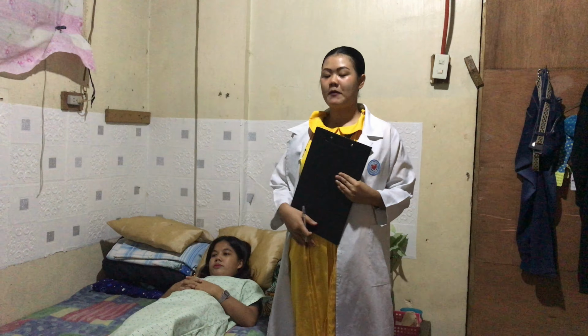So, I'll just check this. For the procedure that I will be doing on the client, after I check it, what is the rationale behind this? The rationale is to ensure accuracy and to prevent any errors. The next thing that we will be doing is to check the materials for the correctness and the functionality of the materials needed in this assessment.